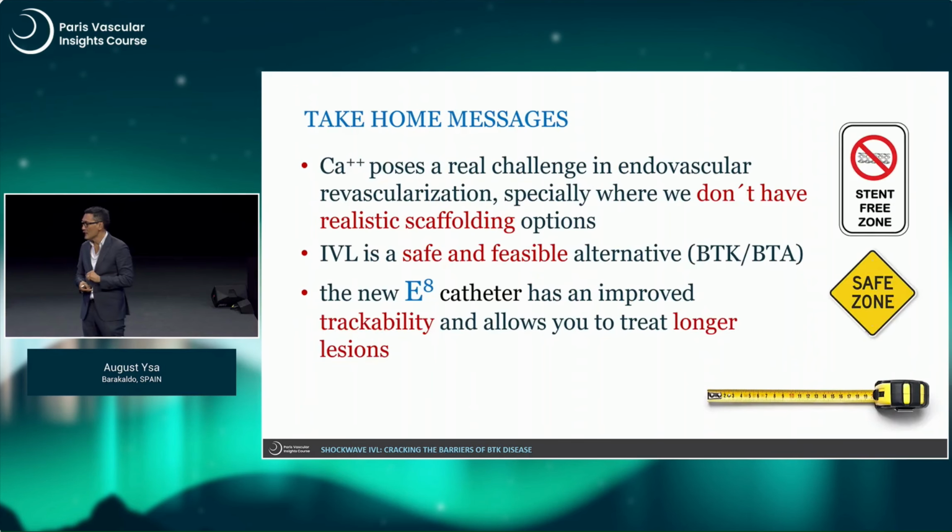So in conclusion, calcium poses real challenges in the vascular treatment, especially in these scenarios where basically scaffolding is not a realistic option. IVL is safe and feasible for the BTK-BTA strategy, and as you have seen, the new E8 has improved the trackability. You can reach the plantar arch and also it allows you to treat longer lesions. And with this, I finish.